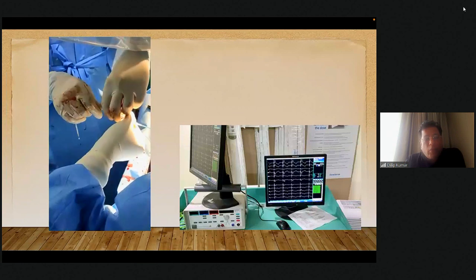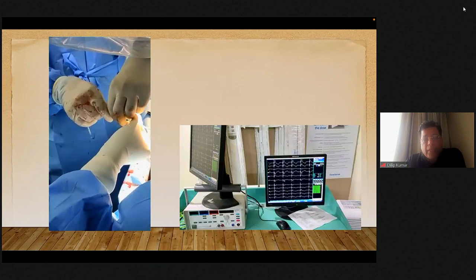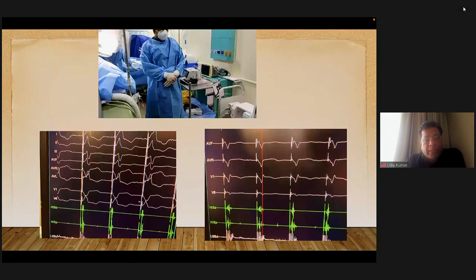While you go in, you have to give slightly quicker rotations, and you can see in fluoroscopy how far advanced you are inside the septum, and the electrical parameters can also tell you. You can see a W pattern in V1, and once you start going in, the terminal notch starts going up, you get an R wave in V1, and the QRS becomes narrow.